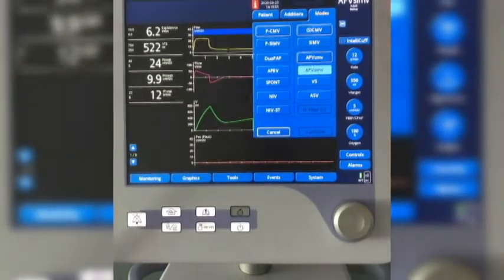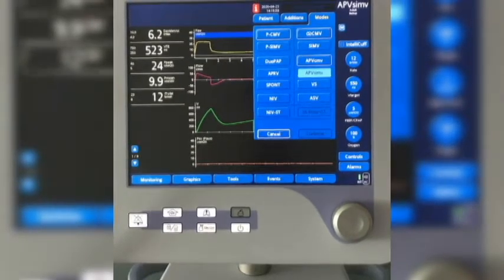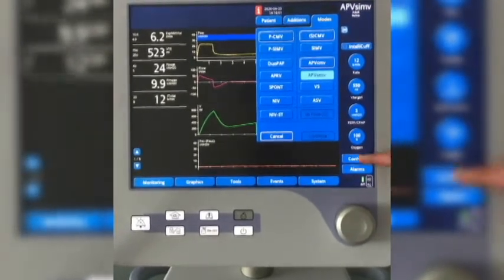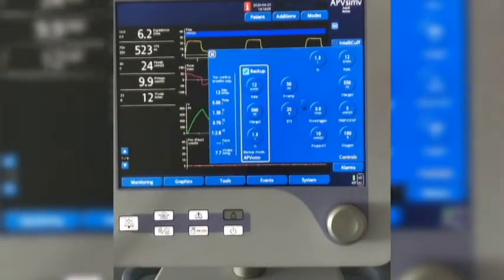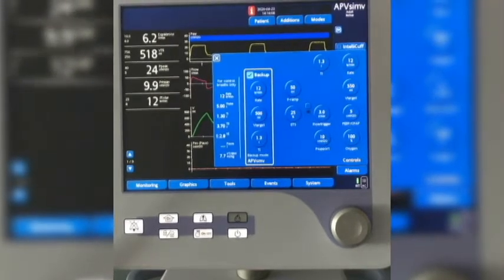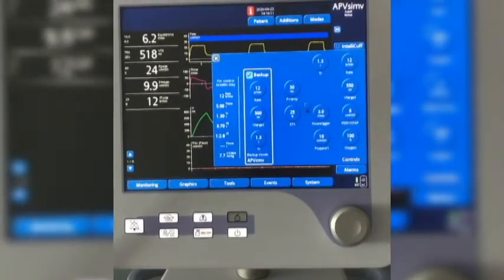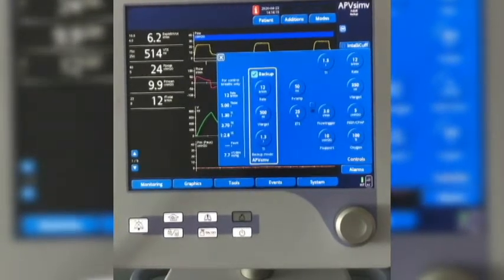Therefore, depending on what mode or breathing program the respiratory therapist has chosen, there might be different settings that are available to them. These settings include things like how fast the breath goes in, how large of a breath we want to give the patient, how long of a breath we want to give the patient, how much oxygen, etc., and whether we're giving them these breaths with either volume or pressure. It's important to note, though, that every patient will have individual and unique ventilator settings that are tailored to their individual needs.